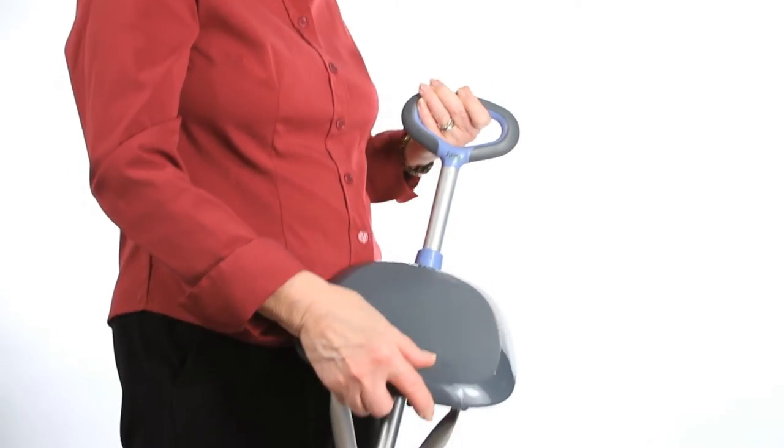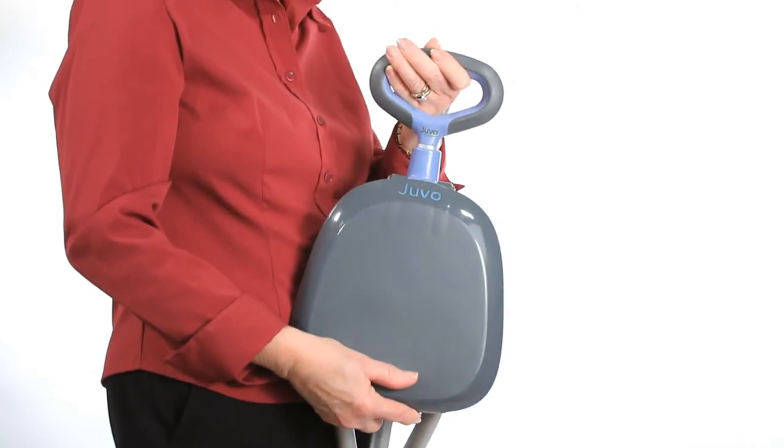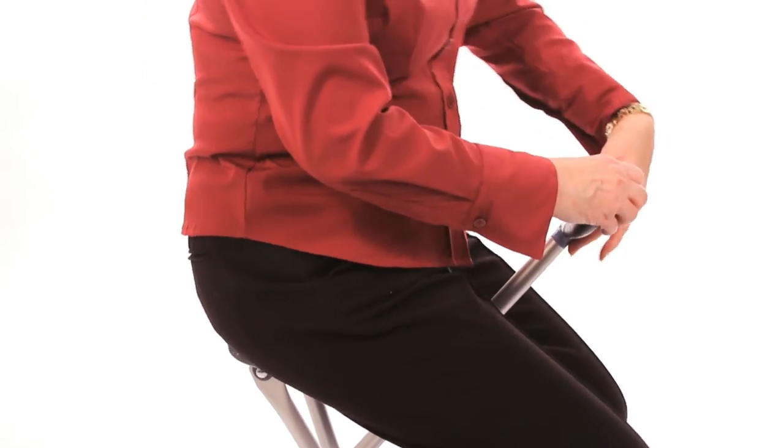While lightweight, the Juvo Travel Seat and cane is very sturdy, accommodating up to a maximum of 250 pounds of weight.